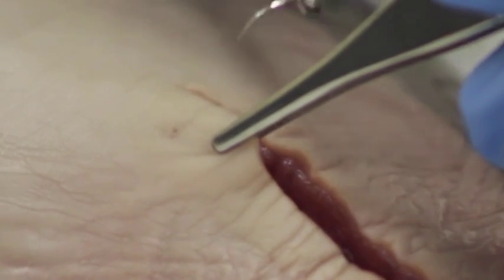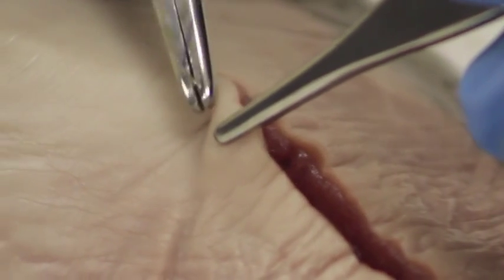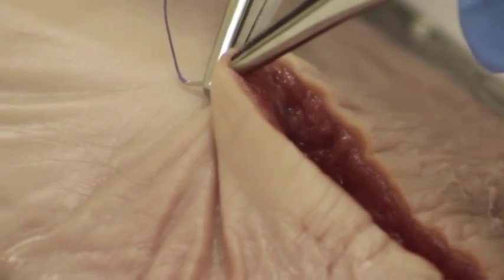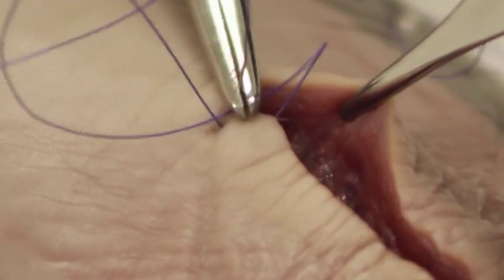We go perpendicular, come through the middle, don't grab the tip, come around the other side.